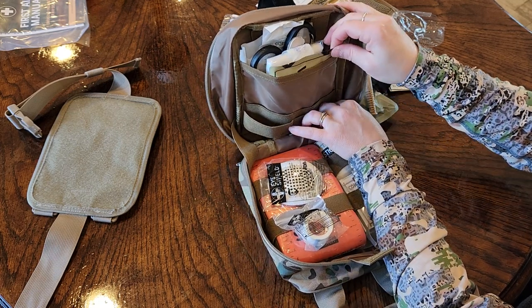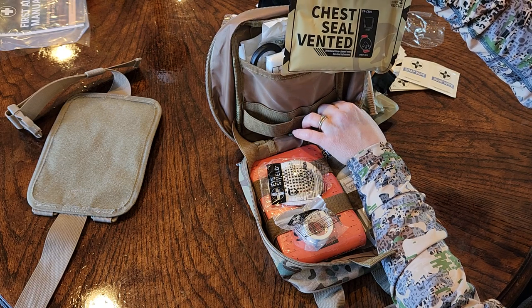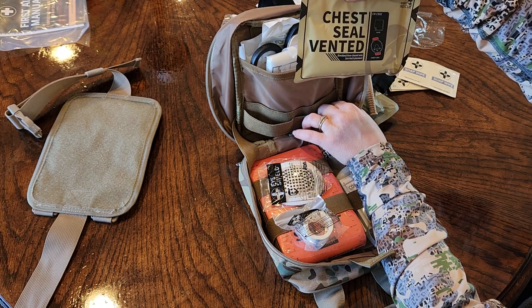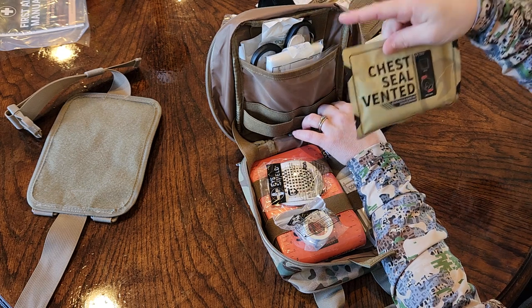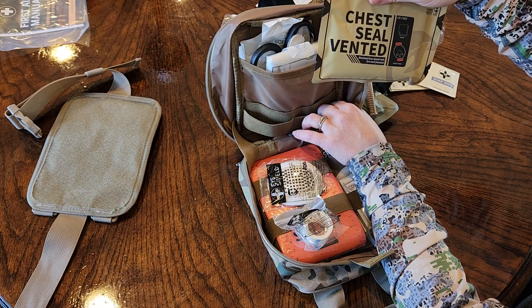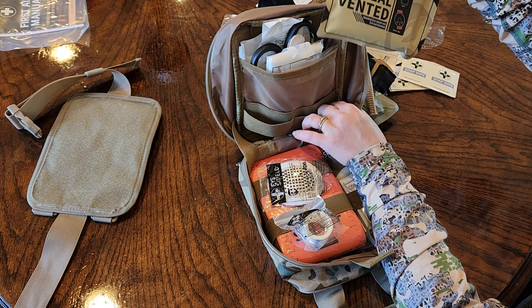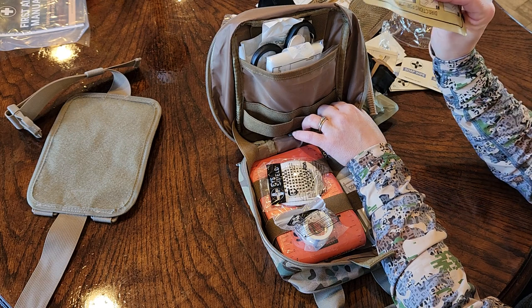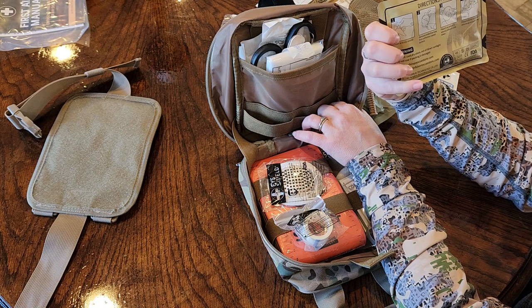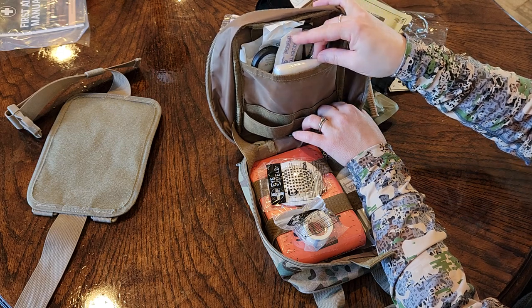So, continuing on. Keep moving, girl. This is your chest seal vent. Basically, any puncture wound to your chest, you need a 3-sided occlusive bandage. It's just 3 sides that are sealed, so the air can escape. So basically, you're keeping that patient able to keep breathing in and out. These are always good to have, and it shows you what to do and where to put it. This is for rib cage areas only. You wouldn't do that over your stomach or anything like that.